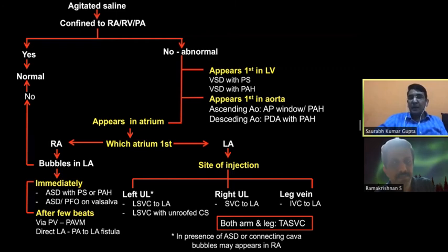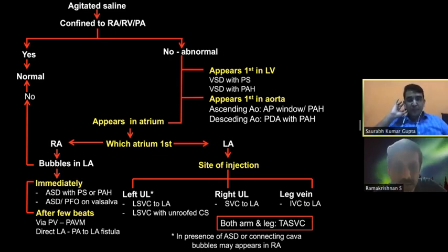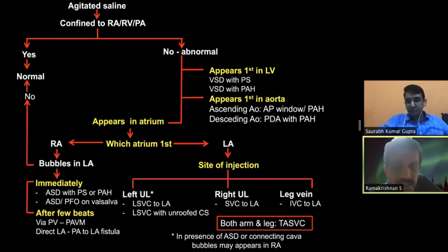But if you are not suspecting a left arm problem, then you may do it from the right arm. But in a patient who doesn't have a left SVC, which you can see easily by 2D or color Doppler echocardiogram, doing the left arm also gives equally good information about the right SVC. So that is another reason why left arm injection may be useful in almost all cases. Lower limb injection, I have generally done only when there is a serious doubt about right to left shunt, but not otherwise. One of the last questions that have come is, can saline contrast echocardiography be lethal at any time?